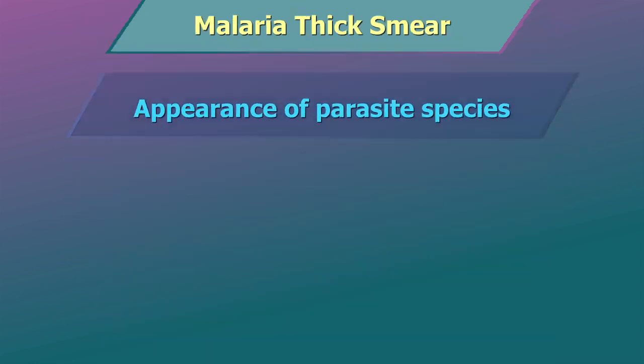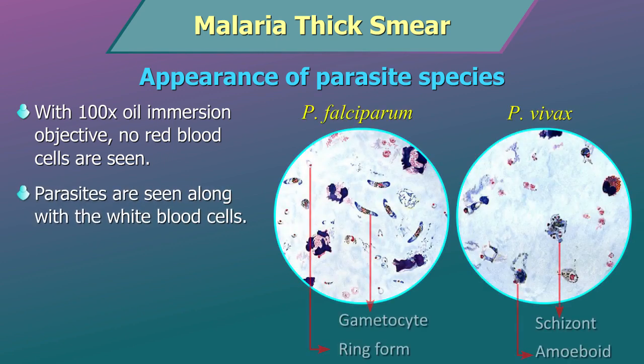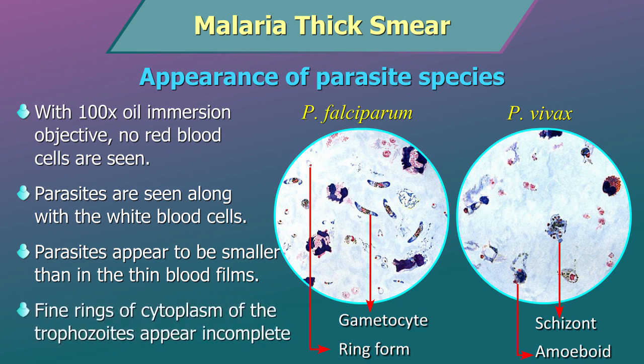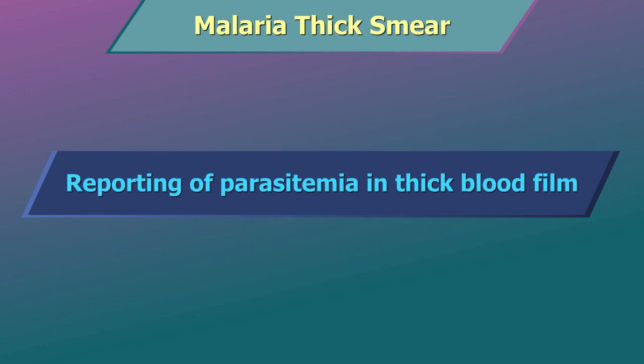Appearance of parasite species. In a thick blood film with 100x oil immersion objective, no red blood cells are seen. The malarial parasites are seen along with the white blood cells. However, the parasites appear to be smaller in the thick film than in the thin blood films. The fine rings of cytoplasm of the trophozoites may appear incomplete or broken in thick blood films. WHO recommends that at least 100 fields, each containing approximately 20 white blood cells, be screened before calling a thick smear negative. Reporting of parasitemia in thick blood film.